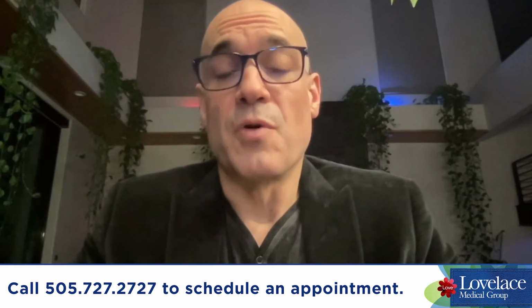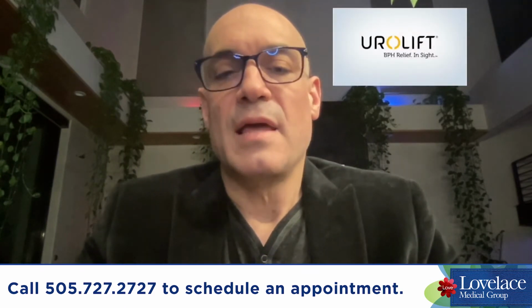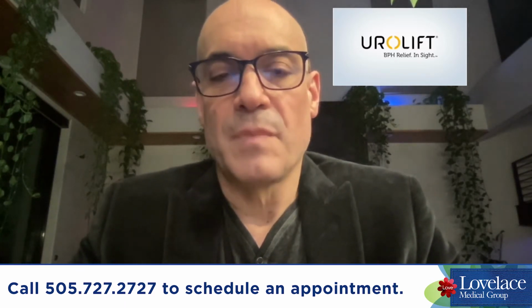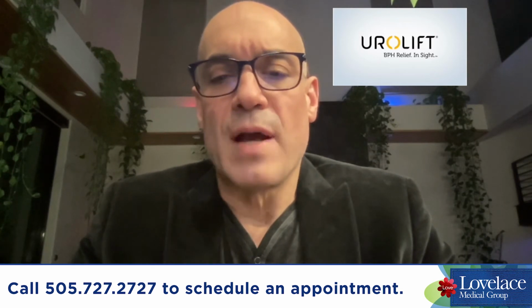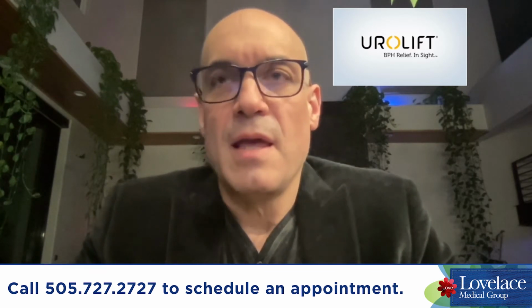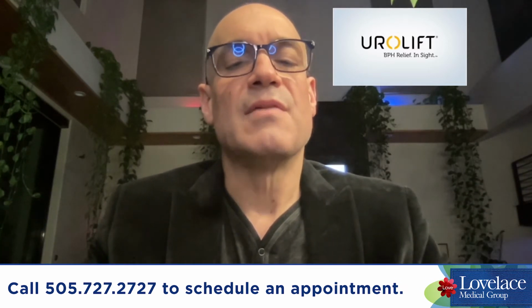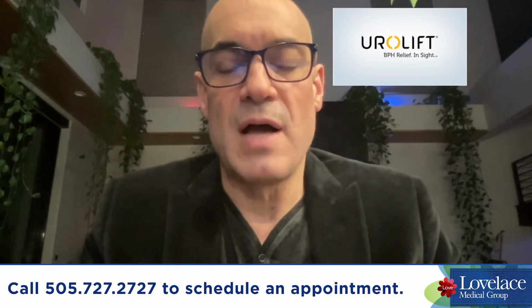So the first procedure, the prostatic urethral lift procedure, otherwise known as Urolift, is a minimally invasive technique that's done in the operating room here at Lovelace that generally takes the surgeon about 10 to 15 minutes to complete. Under a light anesthesia, the instrument is inserted in the reverse direction the way the urine comes out. So the device goes into the urethra and into the prostate. This device will deploy a small surgical clip that, if you placed it at the 3 and 9 o'clock positions inside of the prostate, lifts it up and out, and by doing so, increases the width of the channel that goes through the prostate.